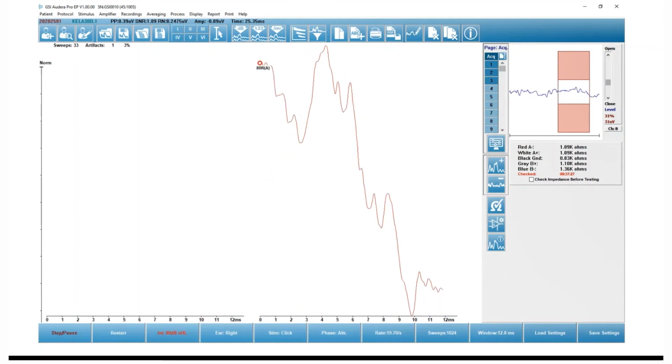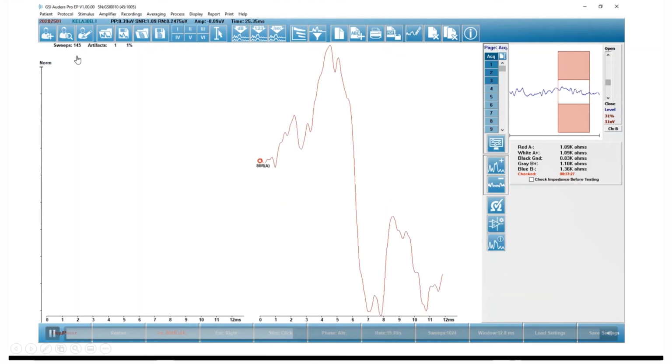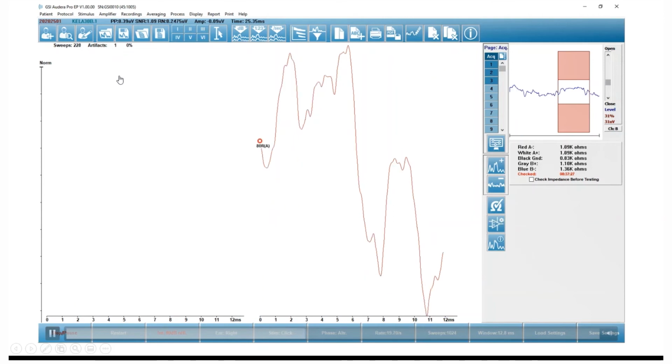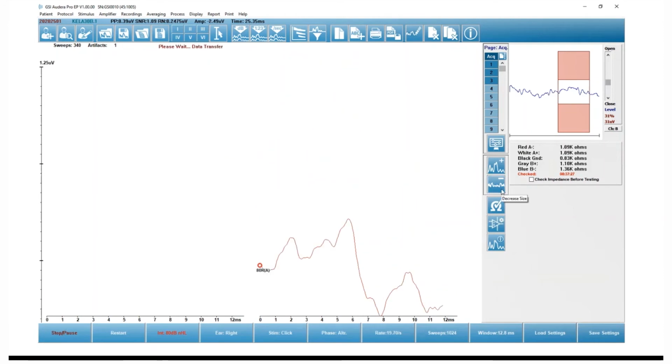So my right waveform is going to appear on the right side. In the upper left corner of that white area, you'll see the number of sweeps as well as artifacts and percentage of artifacts. I can change the size of my waveform if I want by clicking on the positive or negative icon.